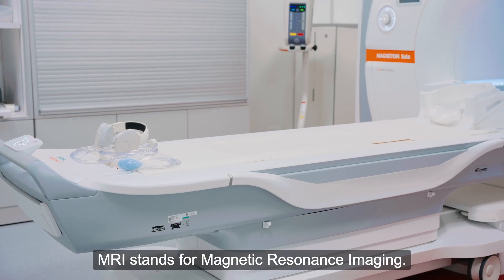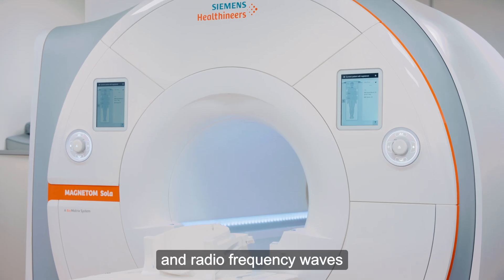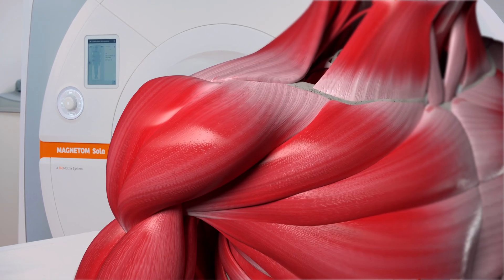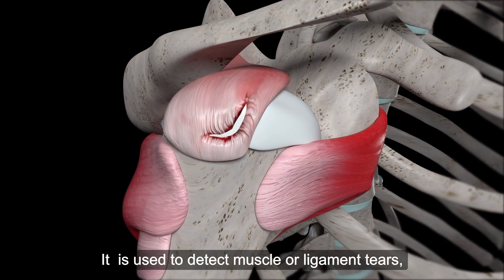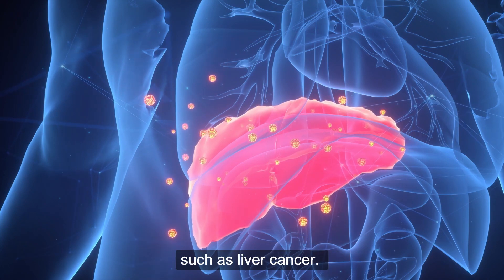MRI stands for Magnetic Resonance Imaging. MRI uses strong magnetic fields and radio frequency waves to produce detailed images of the body. It is used to detect muscle or ligament tears or to diagnose and monitor diseases such as liver cancer.